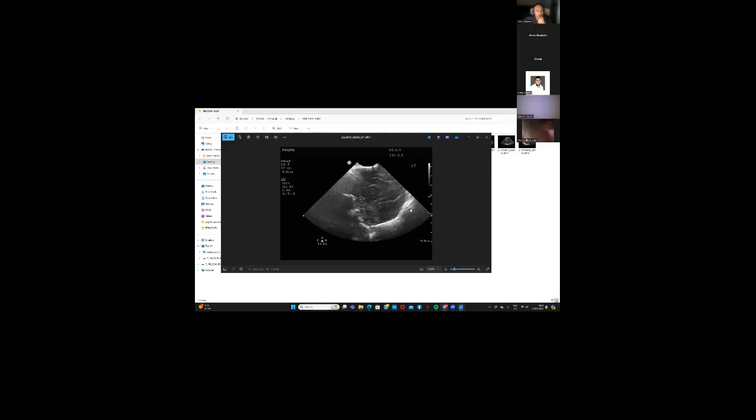Will you be scanning this baby again? Yes, I will be. It'll be really nice when we do the one-on-one next time, if you have a follow-up on this for us to be able to compare. I will do that. Within a week's time, I'll repeat it once again. No problems at all.